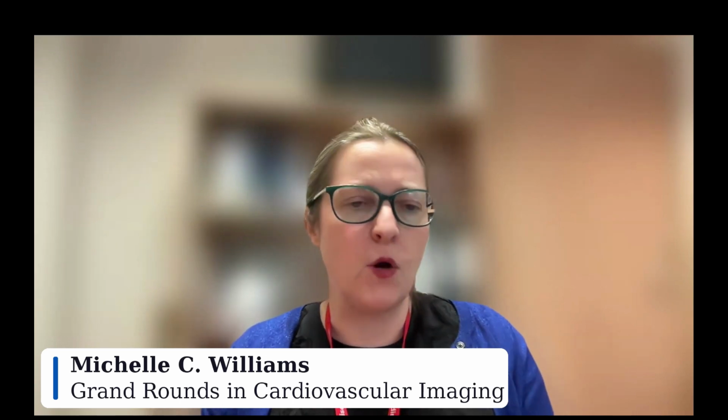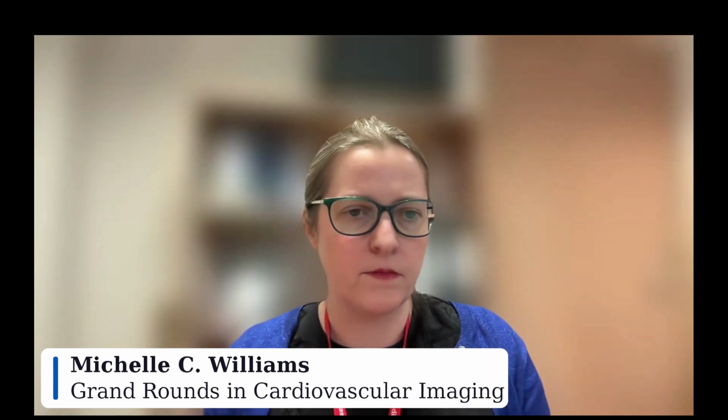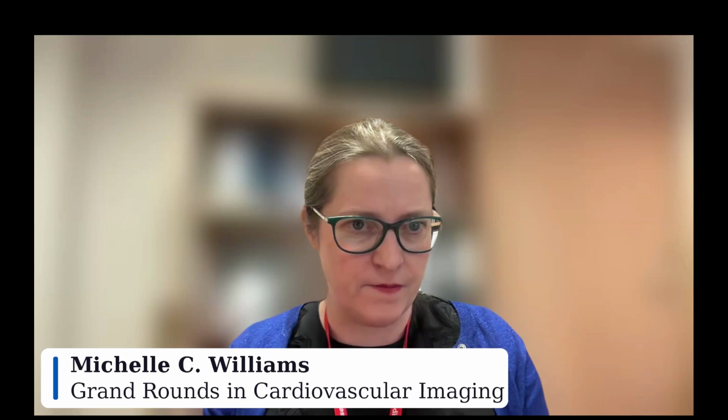Total plaque burden is probably the one that will be automated the quickest and widely available the quickest, because it is quite easy to do. A big important question is whether that is going to be better than just us visually going none, mild, moderate, severe for the P classification. That is an important area that we need to work out from a value added and health economic point of view.